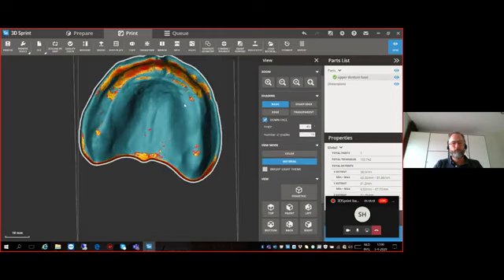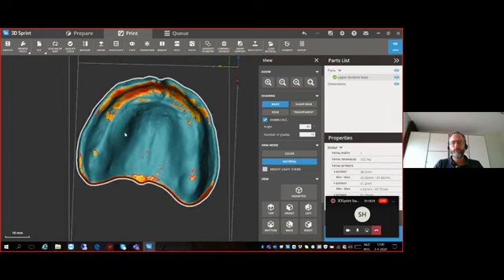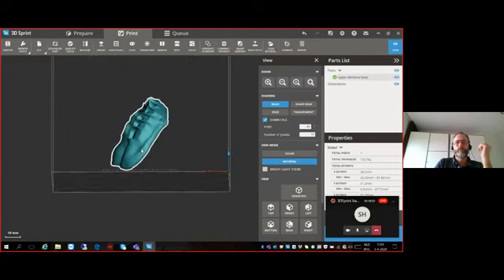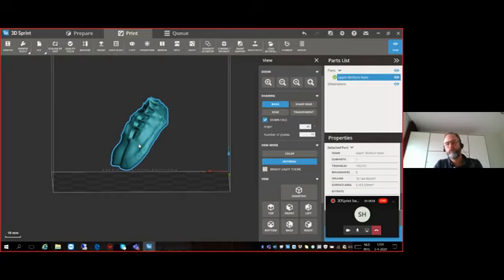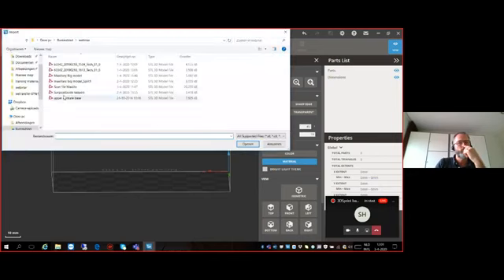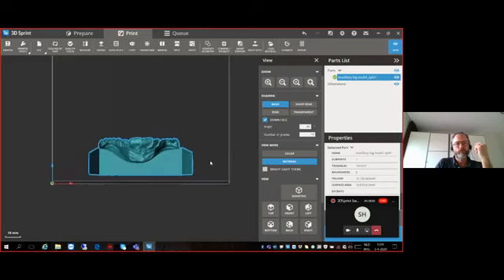Awesome. Very good. And the very last question that I just got in, do we have any tips on printing vertical models? Not sure, this could go two directions. We can quickly show just an orthodontic model placed vertically, so you can fit a lot of models in the build platform. But of course, we also have stacked printing that we released in Chicago Midwinter Show in February, which will roll in automatically into the 3DSprint update, probably end of this month.